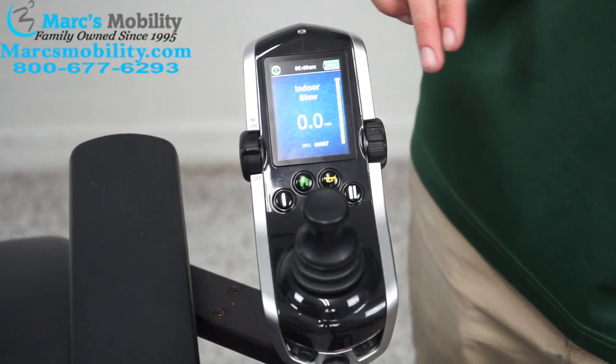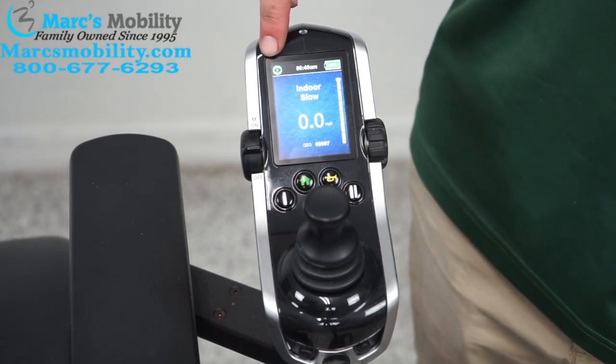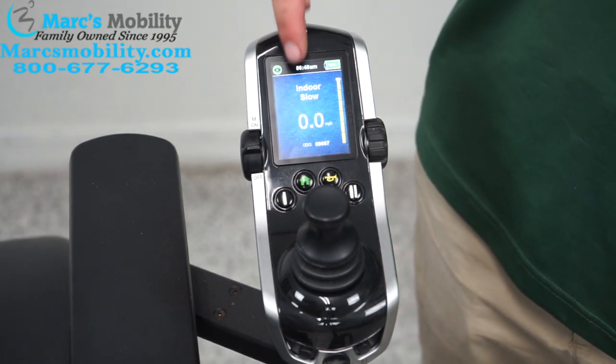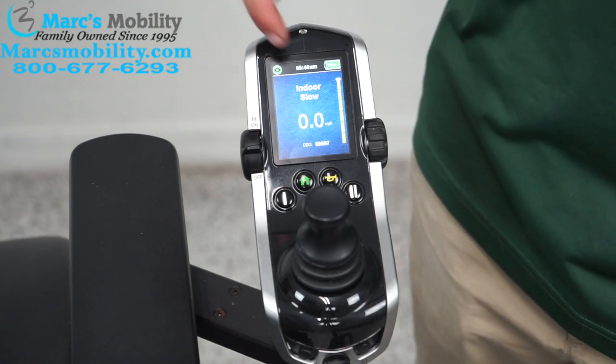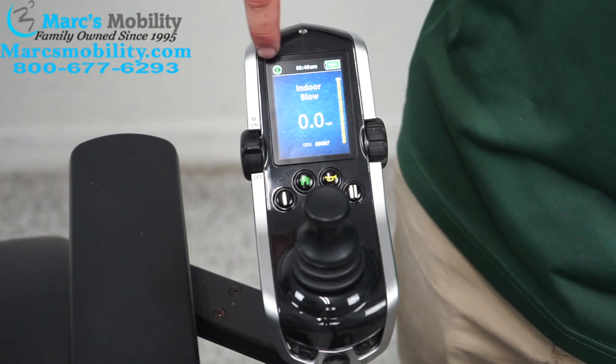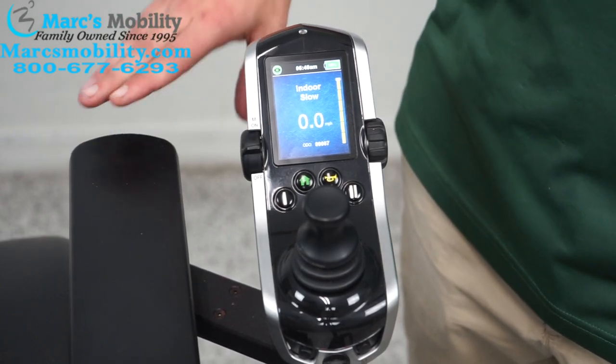We're going to go over this display. Up at the top right is an indicator that shows the position your chair is in. If you have a solid green light, the chair is ready to drive. If you have a solid green light with a little eyeball, this means you're at eye level — this is only on chairs with the eye level seat lift.